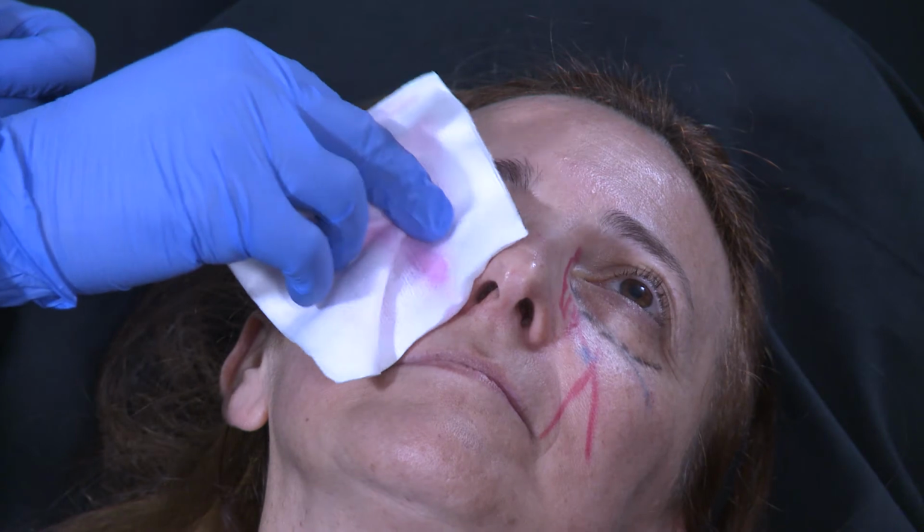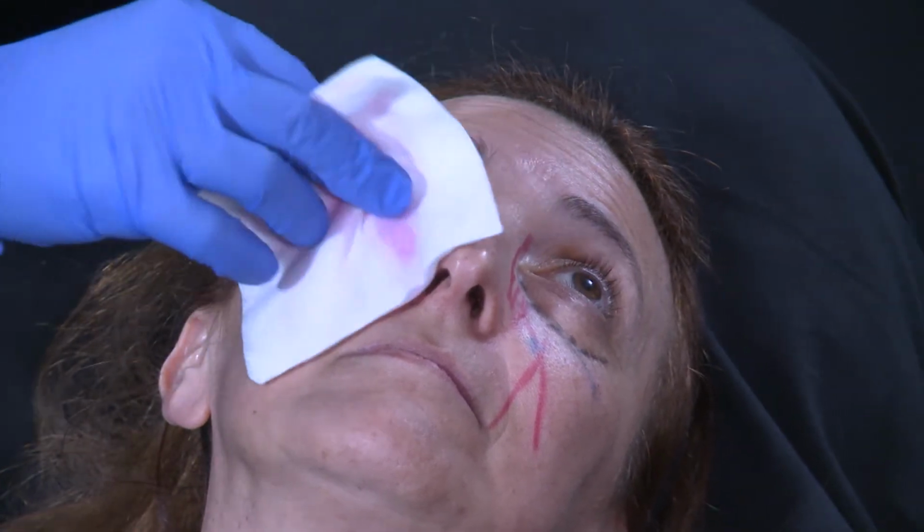So here you see, this is my patient. I will go down a little bit with my table.